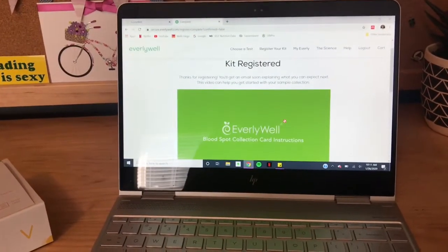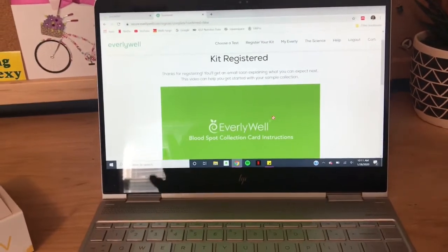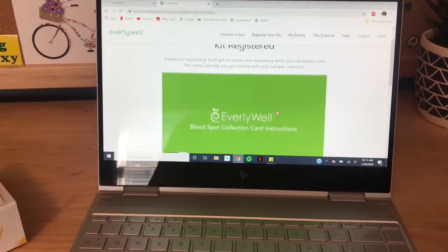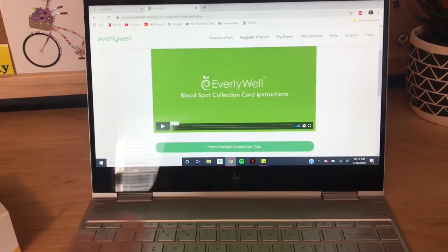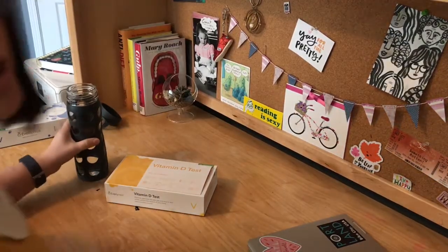Okay, so you go in and you put in the kit ID, and then you answer some questions like your date of birth and who the test is for, submit all that, and then you have successfully registered it, and they have an easy video to watch if you need some extra tips. Alright, getting hydrated.